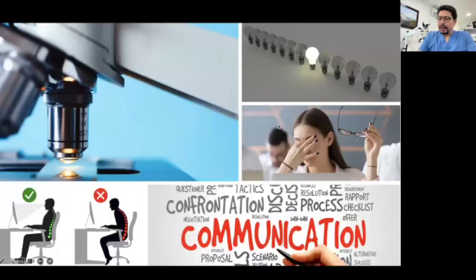So let's talk about why do we need a microscope in our office. I can think about 5 main reasons. The first one is obvious, because of magnification. The microscope can go in different steps, and the range of magnification most of times is going from 4.5x to 24x, and with small variations because of the focusing distance, the magnification in the binoculars, and there might be some small variations.